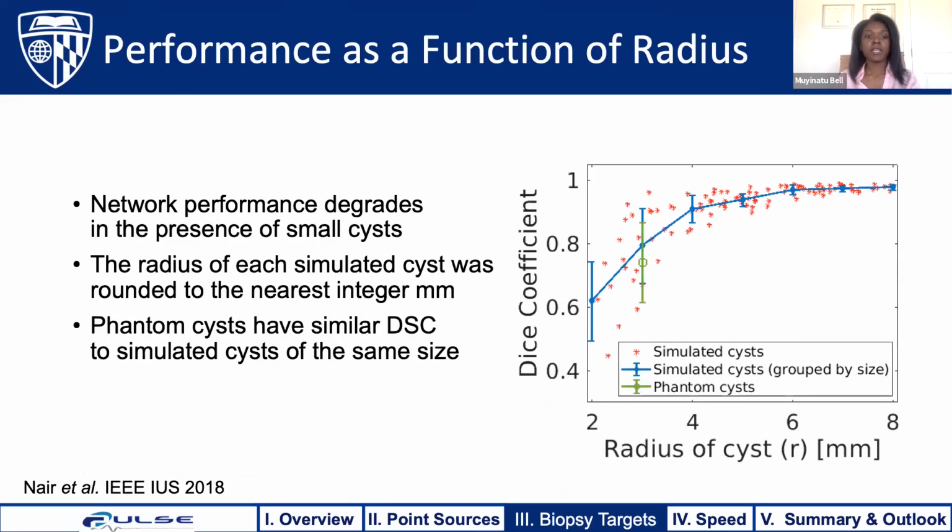For comparison, we added the experimental phantom results shown in green, leading to 2 insights. First, we confirmed that we can achieve good agreement between simulation and experimental phantom results, as you see here, because the green result matches the blue result very well. Second, we see that it is not possible for the experimental phantom result to be any better than the simulation test results.